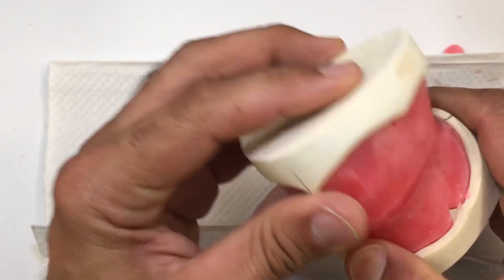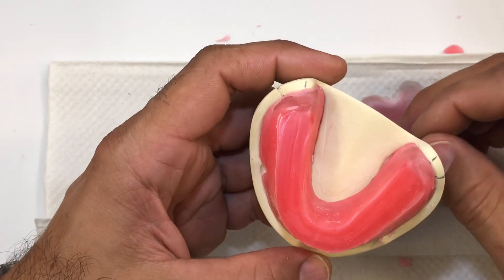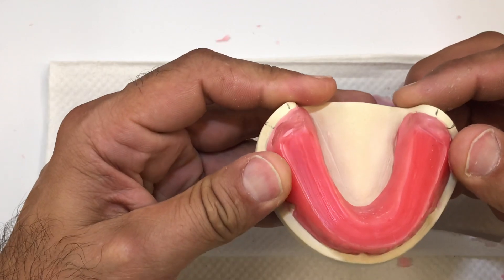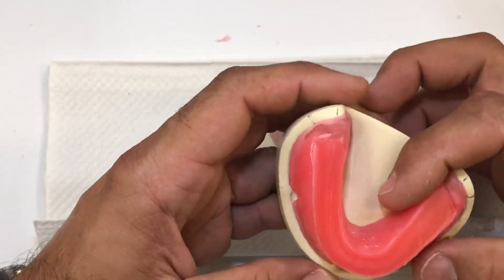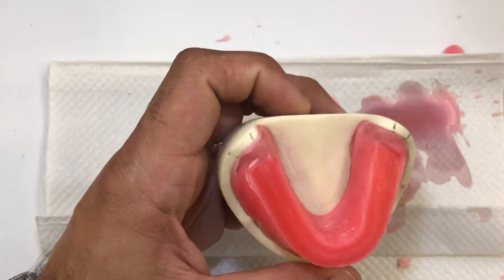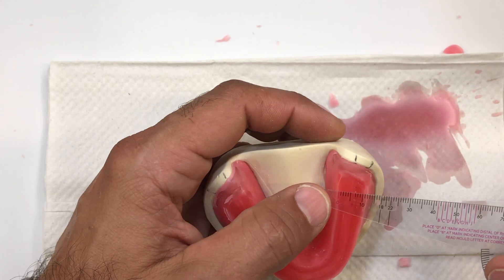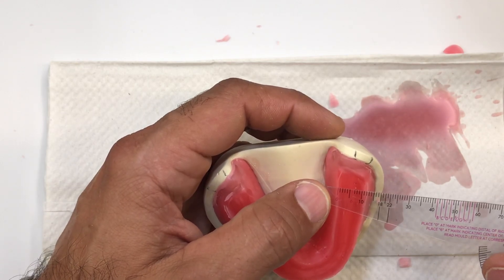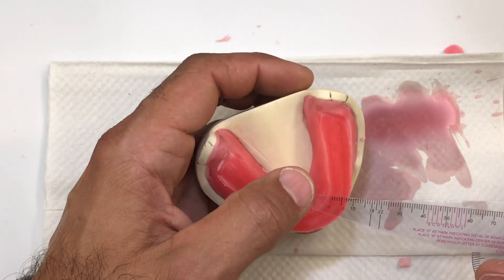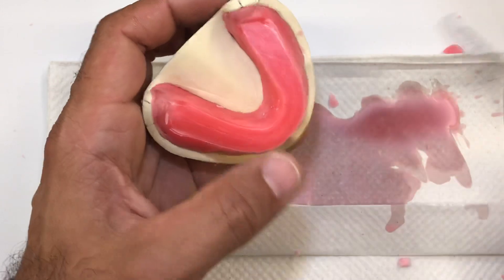From here on, I want to make sure I'm at the right width for this bite block. There's no point having proper arch form and the right height without considering the width. In terms of width, we need about 10 millimeters. Right now I have 12 millimeters around the first and second molar area, closer to six around the canine, and closer to four at the midline — so this is a little wider than it should be.